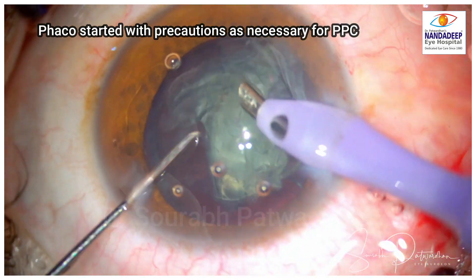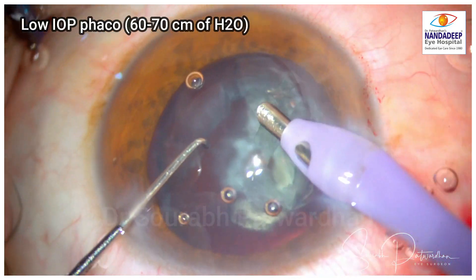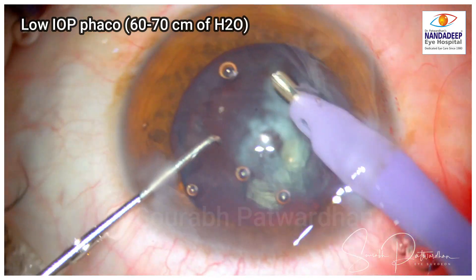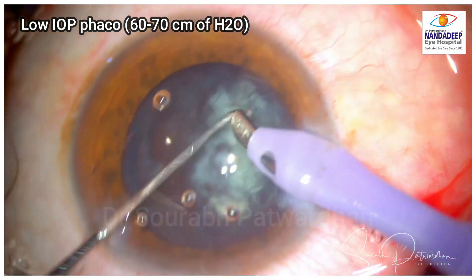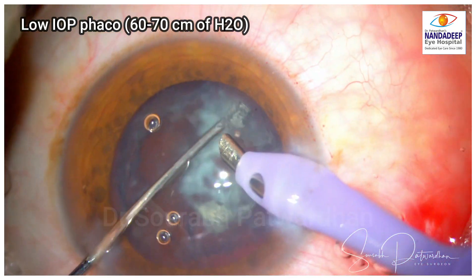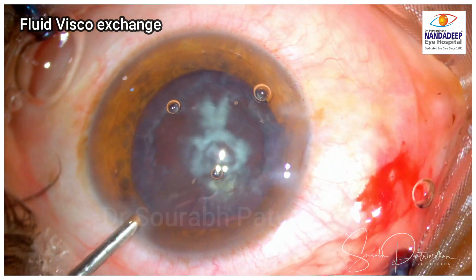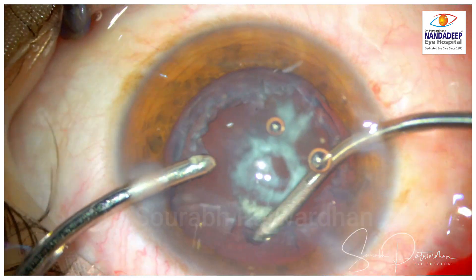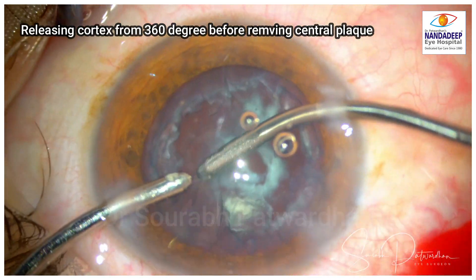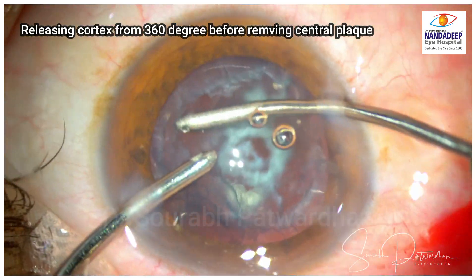To remove the nucleus, there was no rotation — just division and then aspirating the two halves. This is a soft cataract, so no problem with that. Always maintain low IOP, with bottle height around 60 to 70 centimeters. Always perform fluid-visco exchange to avoid shallowing of the anterior chamber. I'm using bi-manual here to release the cortex 360 degrees.